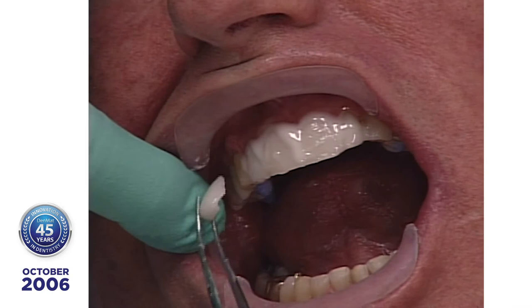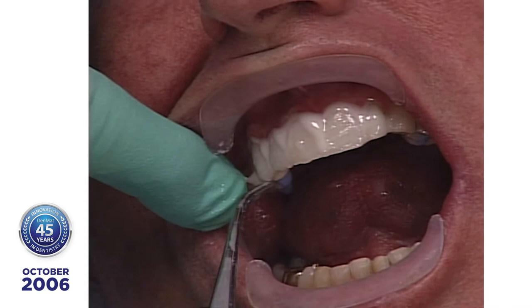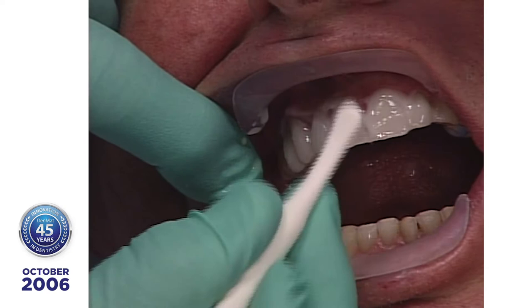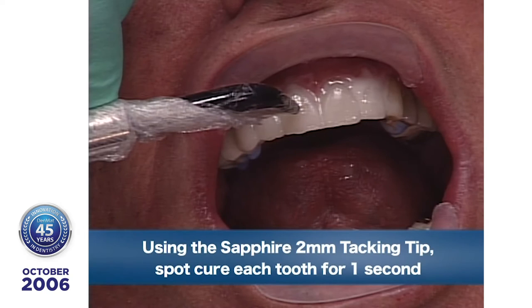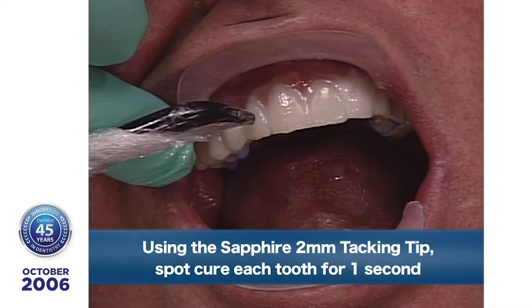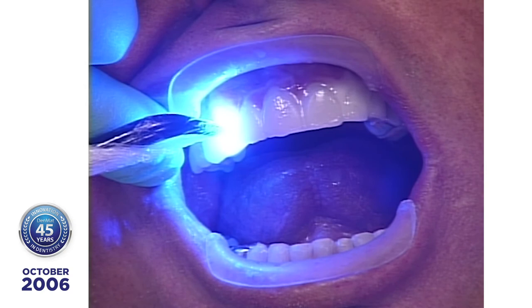Cuspid? Okay. So we'll stay on the right side. I want to get that left one on pretty quick. What I'd like to do right now is get the 2 millimeter tip for 1 second. Be sure you see excess come out. Close your eyes. If you don't see excess come out, you may have a void. Close your eyes.